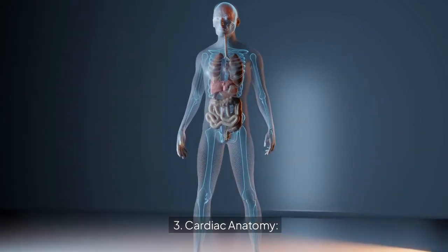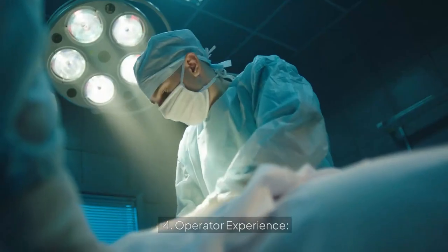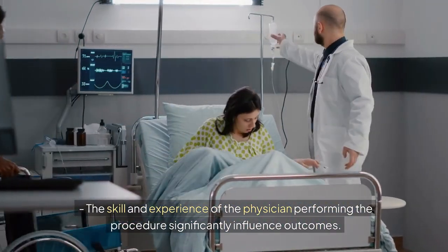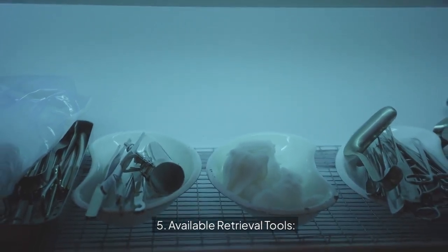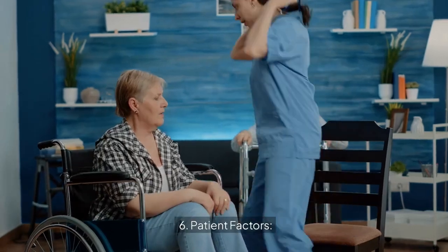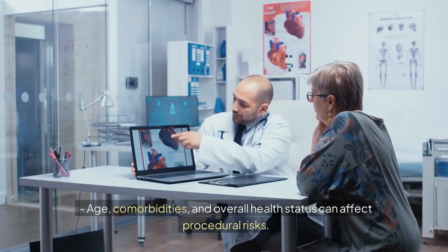3. Cardiac anatomy. Individual variations in cardiac structure may impact the retrieval approach. 4. Operator experience. The skill and experience of the physician performing the procedure significantly influence outcomes. 5. Available retrieval tools. The design and effectiveness of specialized retrieval catheters and tools. 6. Patient factors. Age, comorbidities, and overall health status can affect procedural risks.